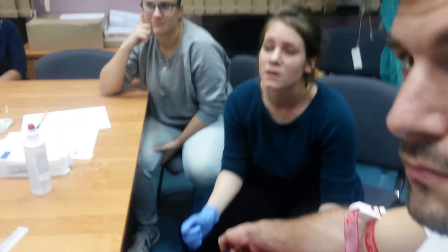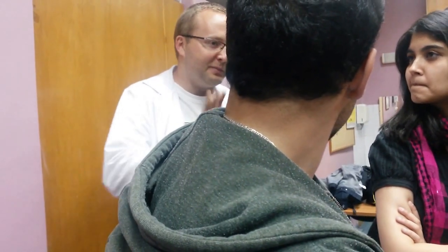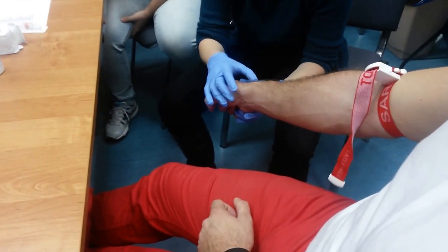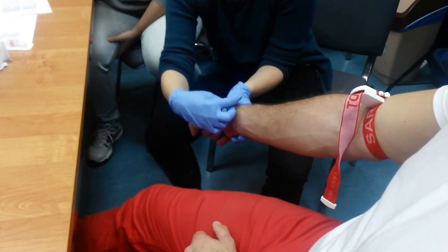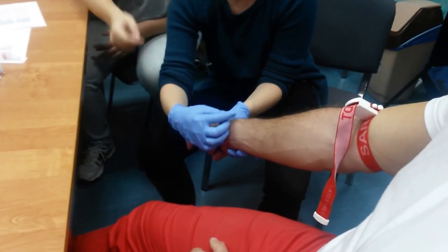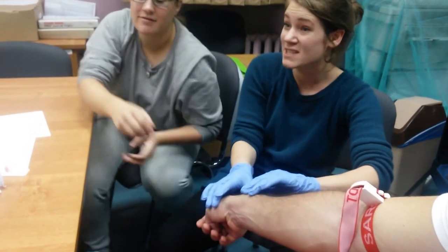We call this the anesthesiological vein because it's the vein which is usually in the same place in everybody. Even if you can't find anything on a patient, especially an obese patient, you can try to kind of displace it and usually you can get it. It's one of the best ones, though it usually doesn't look so good. This one's huge, but last time I did it, it actually rolled away from me.